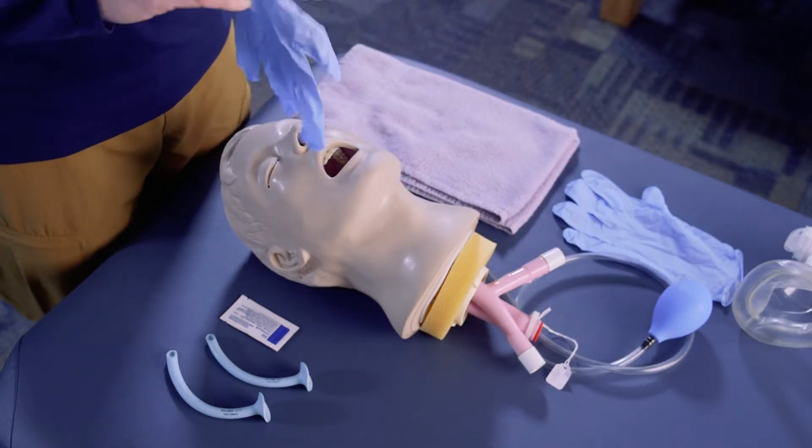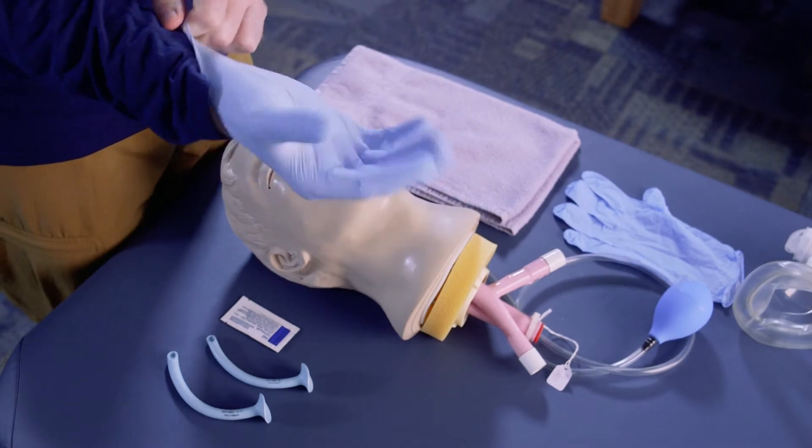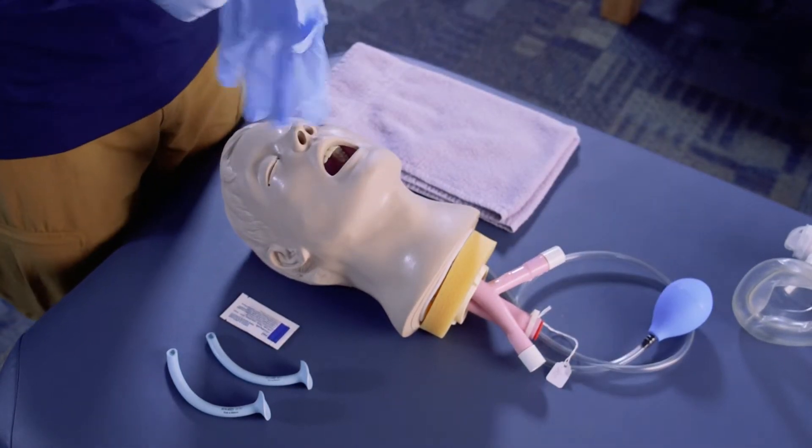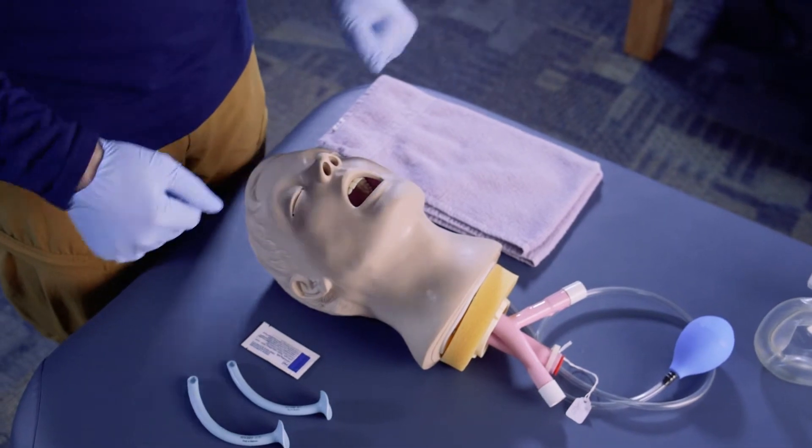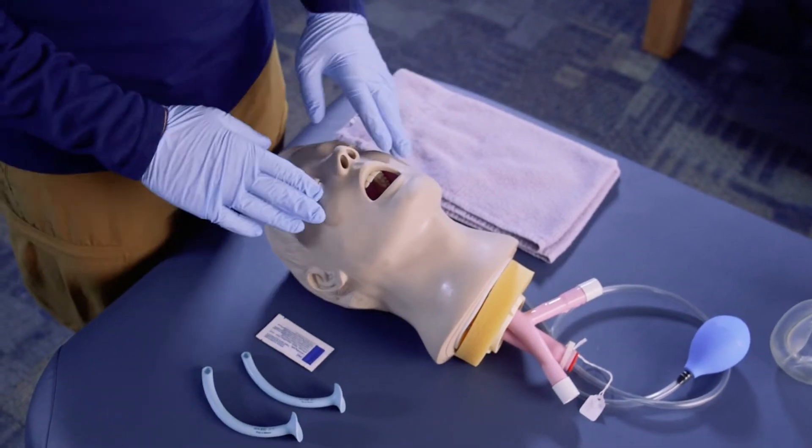The first thing we want to do is get our gloves on and follow any type of biohazard procedure using universal precautions.